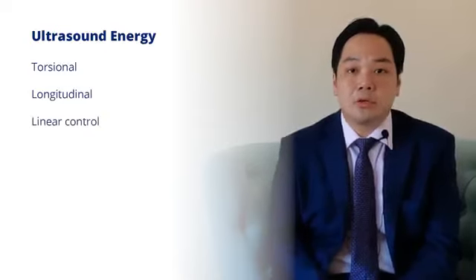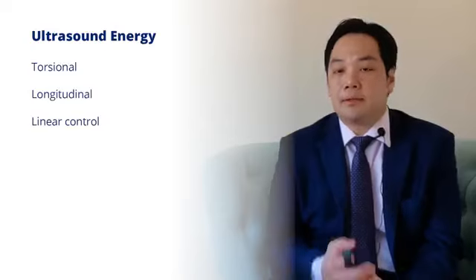Again, that's linear control of the ultrasound energy. And if you had an Alcon technician with you with a new machine, in this case a Centurion, there will always be suggested settings where they will put things in to try and give you as stable an environment as possible, which is a good starting point. So what are these starting points that we have?